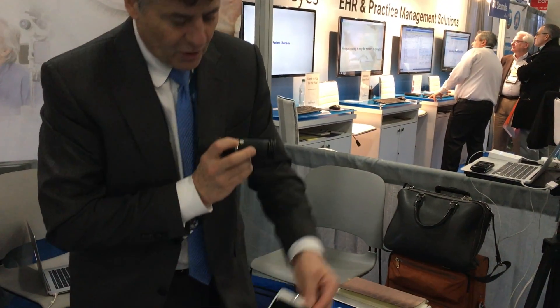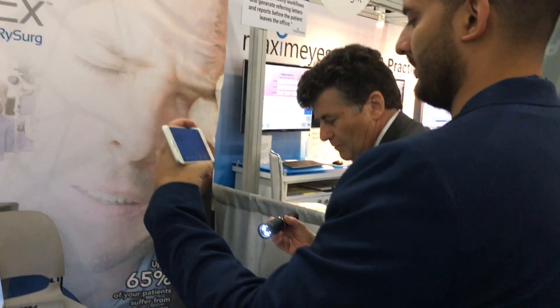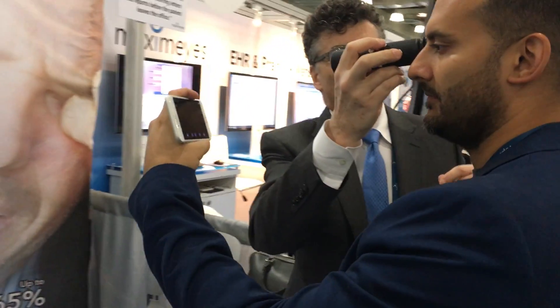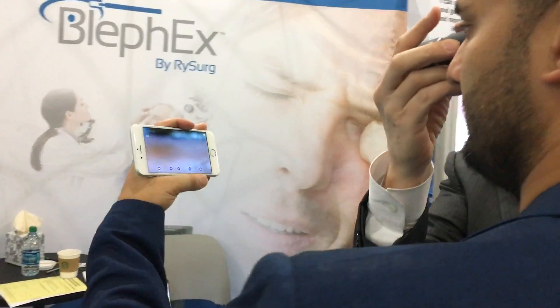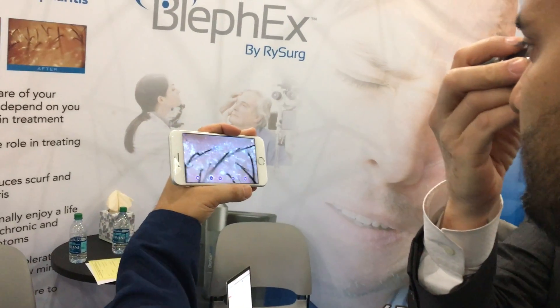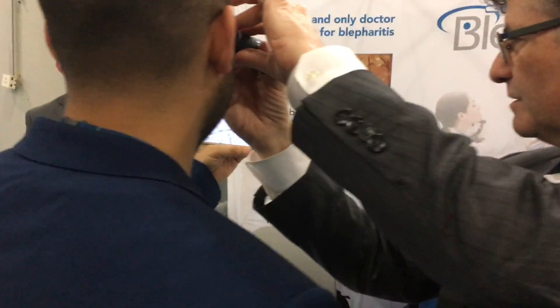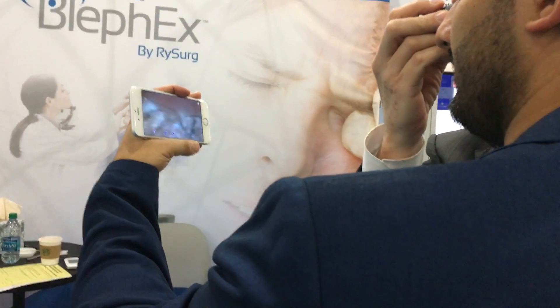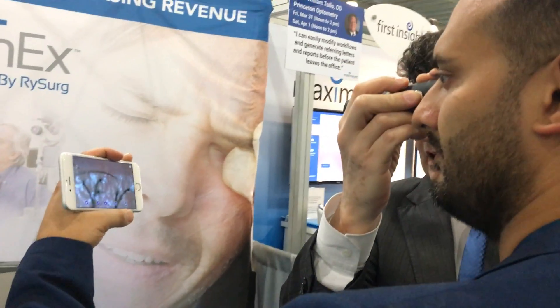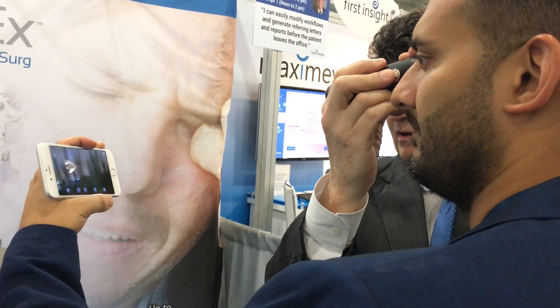Now you be the patient — hold this up in front of you just like a patient sitting in the chair. We're going to manual focus. I can see biofilm — that shiny thing. We all have biofilm. Take a lot of pictures because many will be out of focus. Use the focus piece to capture the upper lids — tip it up for the upper lids and focus your hand.